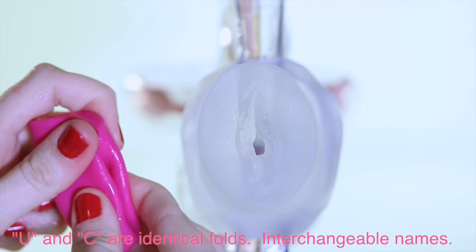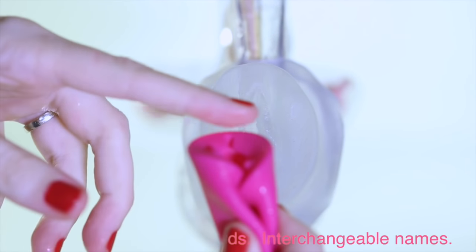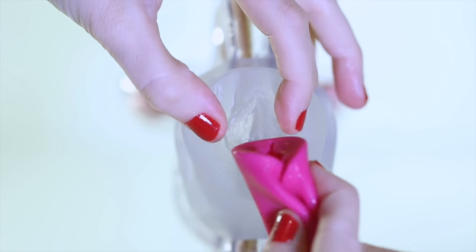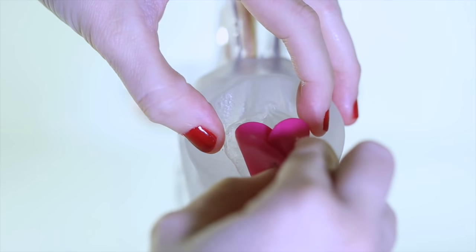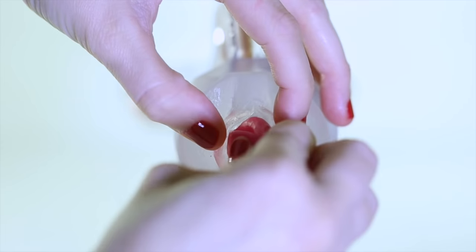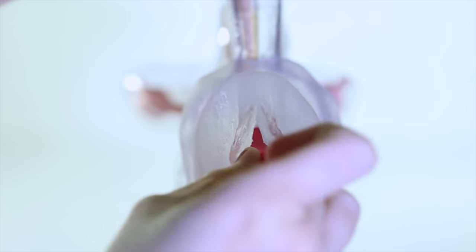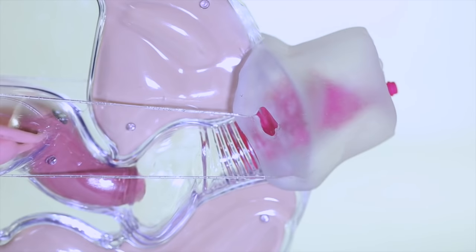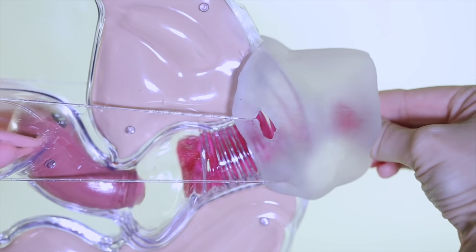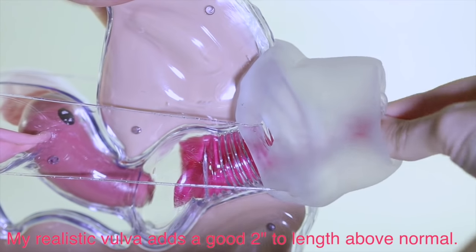I'm using the U-fold, which is a really simple, easy, fast fold that seems to open up very nicely once inside. Just open the lips with your other hand and then gently wiggle it in, then push slowly — you don't have to ram it inside, just push it nice and slow and let it do its thing. As you push, you can see it's going inside but it's not open yet, and once it's up there and ready to open it will pop.